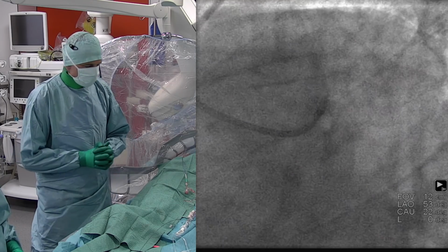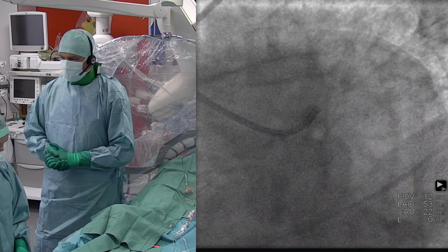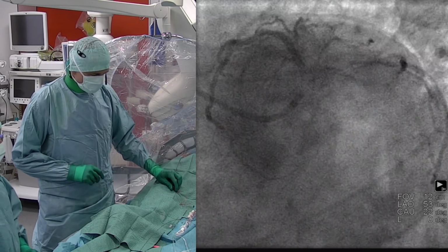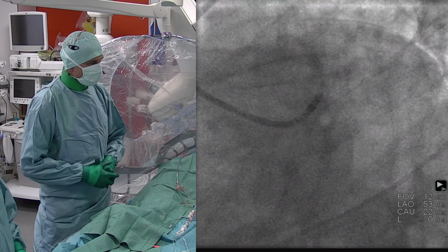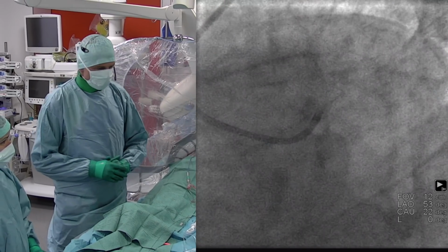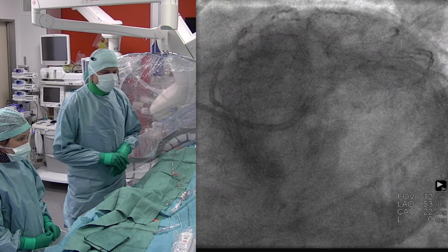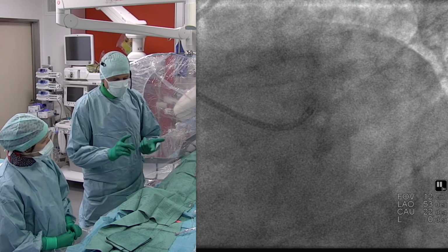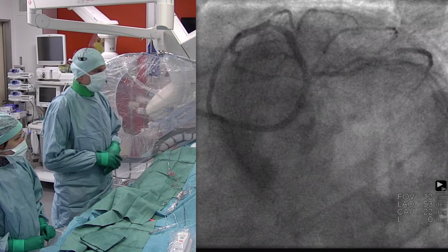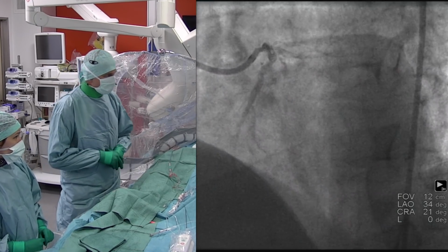Is that okay for you if we proceed, Emanuele? Fantastic. So we can already quickly address one of the questions from one of the colleagues, who asked whether this stenosis in the left main was already present back in 2011. But as you already explained, previous procedures were performed in Greece, so we have no details about this procedure. This was done 7 years ago. We don't know which type, which dimension of the stent. We see the stent in the proximal LAD. We cannot tell whether the left main was diseased. We cannot tell you either whether there was something on the right, but the patient doesn't know anything about that.